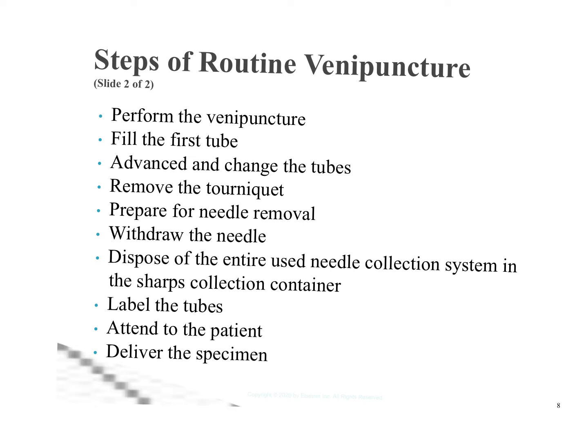We're going to dispose of the entire collection, so the needle collection system, into the sharps container. Label our tubes before we leave the patient's side. Attend to the patient, so make sure their call light is in reach with those types of things, and then deliver the specimen down to the lab.